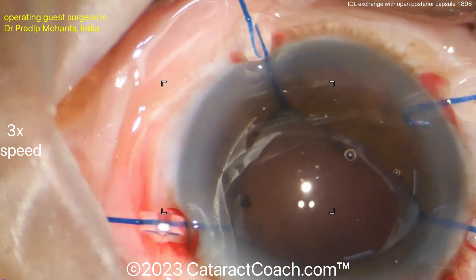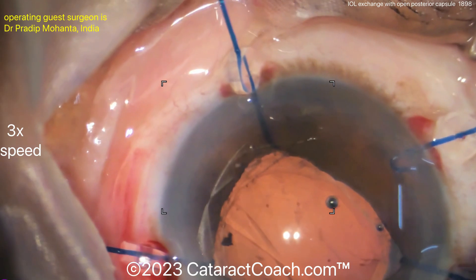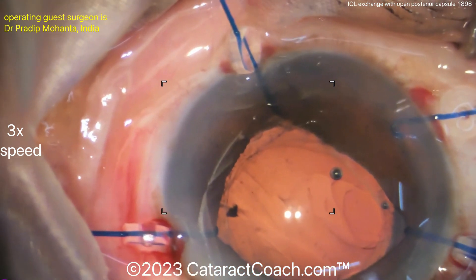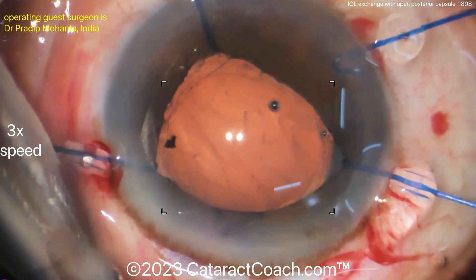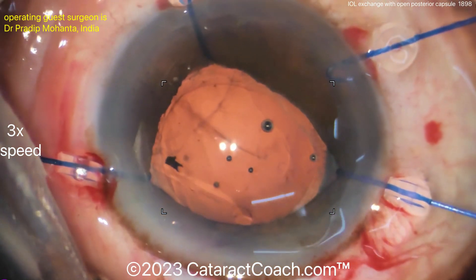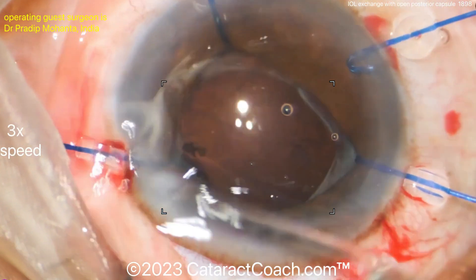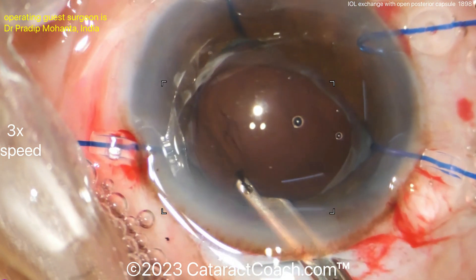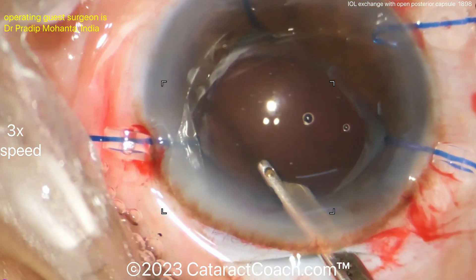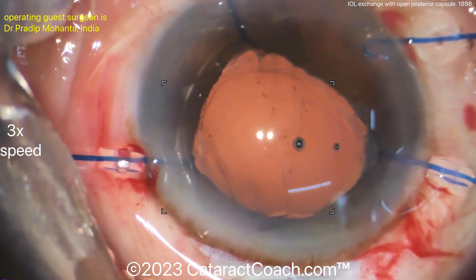Now it's time to do an anterior vitrectomy. Even if you didn't stir up the vitreous much, you'll always end up needing one — especially if the patient has already had a YAG capsulotomy, as in this case. Triamcinolone can be used to stain the vitreous, which is very helpful here. A Simco cannula goes inside the eye to flush out some of the viscoelastic, but be careful as this can cause more vitreous prolapse.